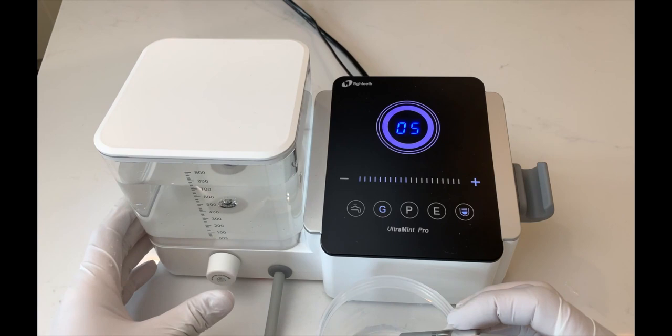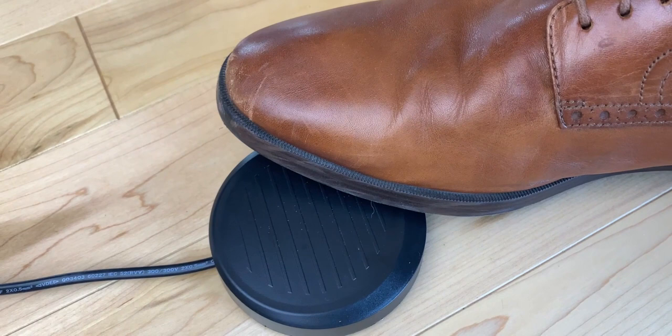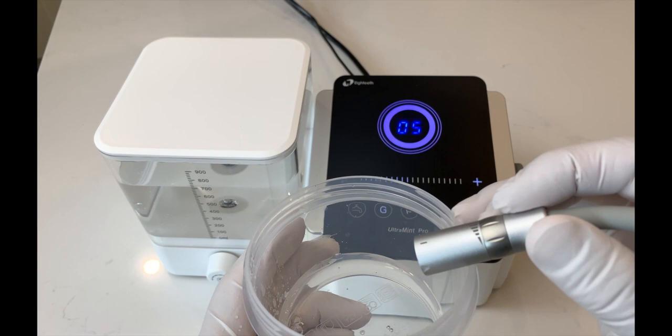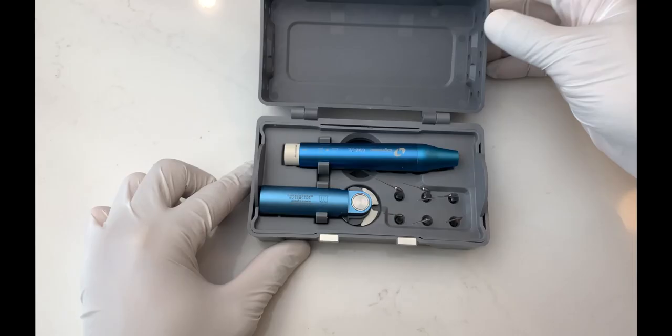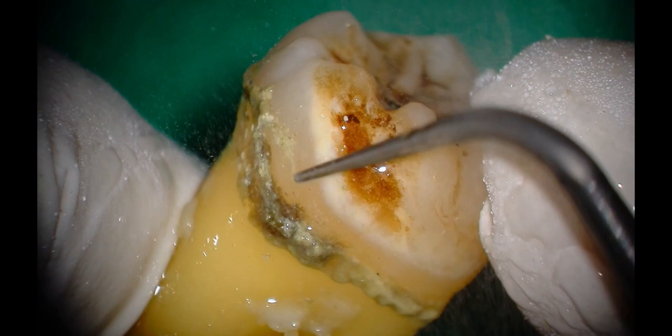Self-cleaning on the Ultramint Pro is a simple process. Just press the water control dial on the unit and tap the ergonomic foot pedal. The self-clean action is automatically controlled and can be stopped by pressing the foot pedal if needed. The handpiece with LED, handpiece holder, and tip box are all autoclaveable.